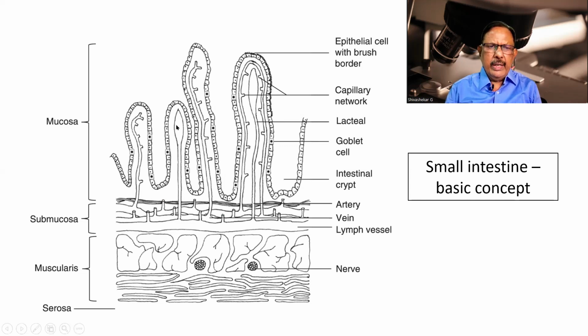This is the wonder part of it, namely the lamina propria. Whatever be the type of epithelium, it needs a support. And this is the loose fibrous tissue, which is usually not seen, which will be the lamina propria, and it will have lymphocytes. These tubes are nothing but the fibrovascular core that I am seeing coming from the vessels over here.